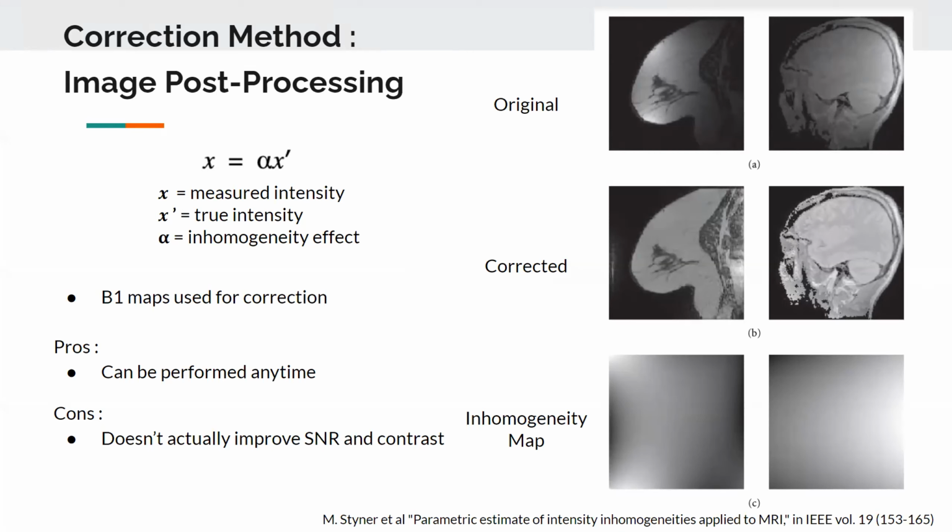But these images were shown with the equation done without including the error, and they were able to show that it was still effective. So I guess the noise would depend on different scans and different images, and you would take that into play in deciding whether you would want to include it or not.